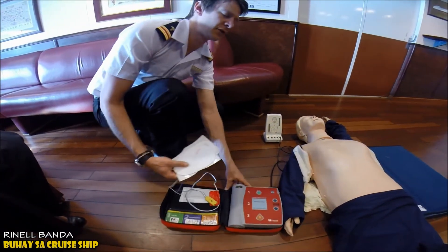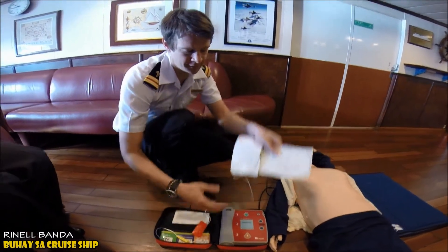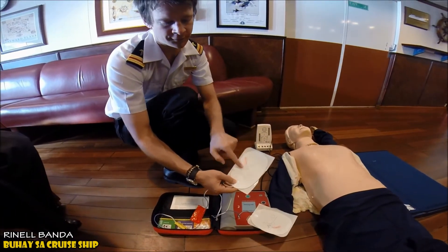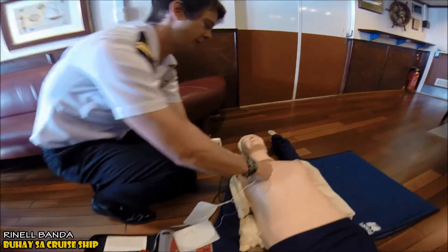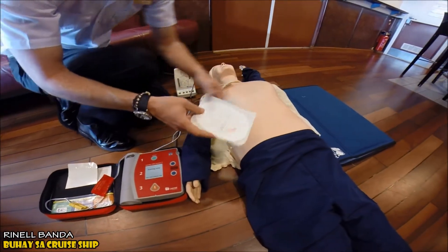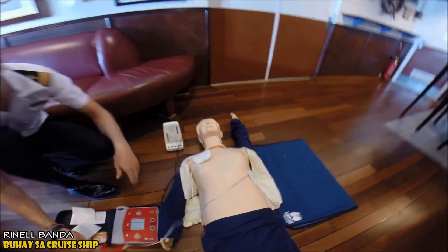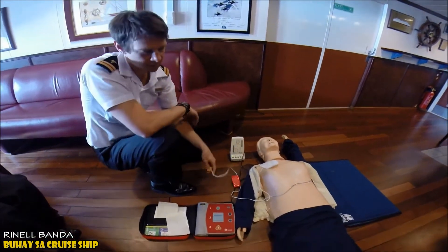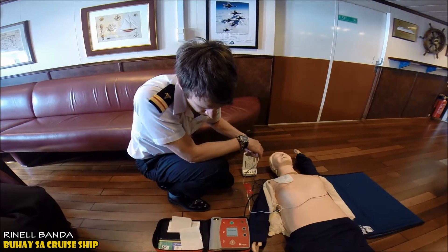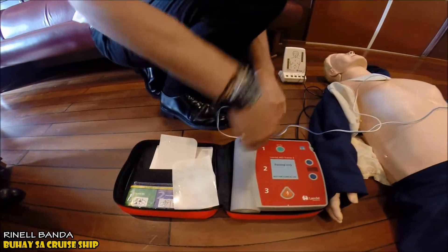Apply the pads to the bare chest. The pads are located in the pack and they have an illustration of where they go. This one goes to the top right chest, and the next one goes to the left side of the chest, just below the pec. These must go directly on the skin. Then plug in the pads connector next to the flashing lights and listen for the prompt.